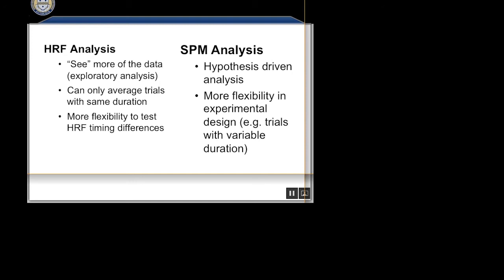So I said this way, it's a two-step model. You estimate the hemodynamic response, and then you choose a window and estimate over a window. Whereas this way, you jump straight to a hypothesis. If you chose the window correctly, if you know that the response comes up, peaks at 8 seconds, and comes back down, then instead of using a constant window that gives equal weight to all these time points, you give a tapered window that goes up and comes back down and use that as your contrast, you get the exact same answer between these two methods.